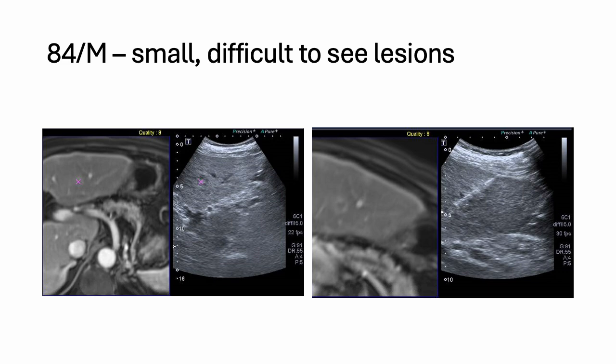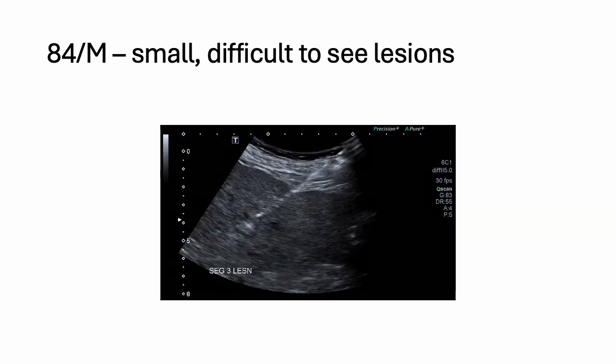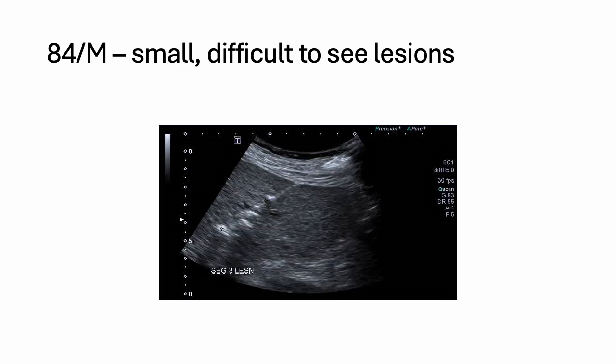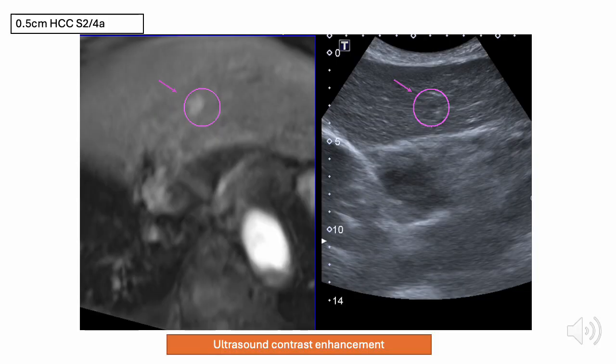For small lesions that are difficult to see, I've found this really invaluable. For example, this patient with multiple hepatic metastases, the lesions are visible, but on a superficial or simple sweep through the liver, it can be hard to see them. But when you fuse, it becomes very easy, and here the needle is advanced through the lesion, fairly straightforward. Ablation is performed with standard technique, and you get a good margin.